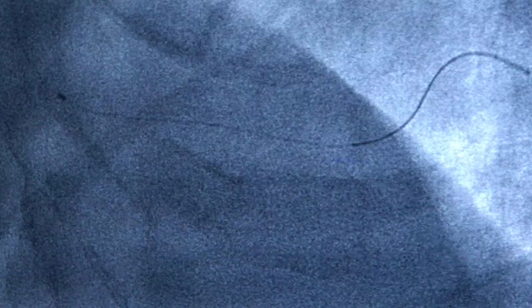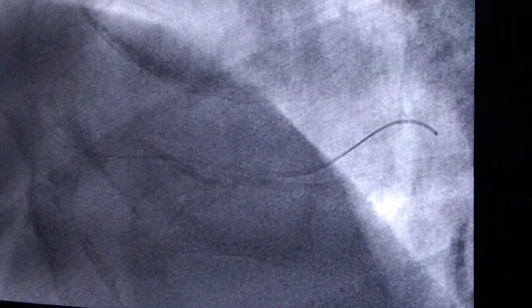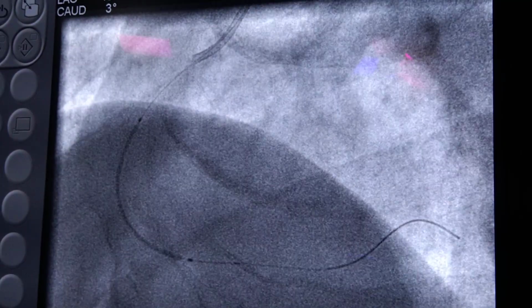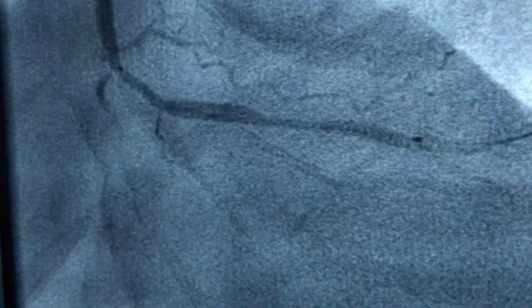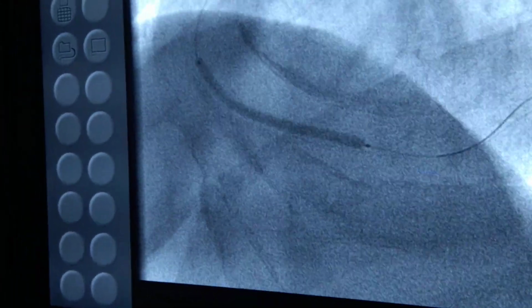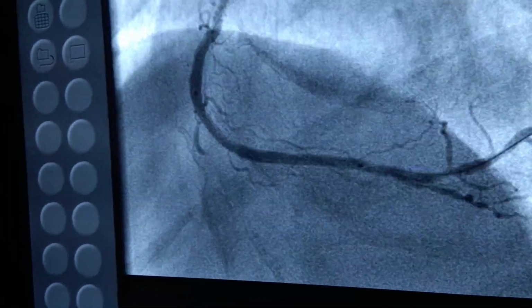We did the pre-dilatation of the distal segment and also of the mid to distal segment. Then we thought the vessel is of good size, and we could deploy the stent, because we had measured that 38mm will not be enough. We have done a 43mm long stent from Vascular Concepts, the Pronova XR stent, 43mm long, 2.5mm in diameter. The result immediately after this is good. You can see the result is perfect.